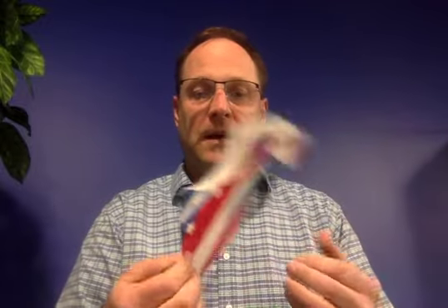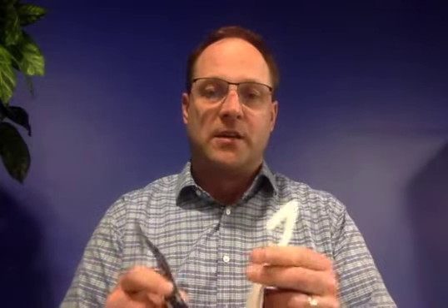to protect yourself. Now, this is not a dust mask, it's not a breathing mask, so it's just paper and really just meant to stop moisture and droplets, liquid droplets from contacting your face. So if you are sneezing or coughing, you're going to protect others, and you're going to protect yourself by not letting that liquid travel across the room, right? Also, if you have a mask on or a shield over your face, you're not going to touch your face. So that's the purpose of this.